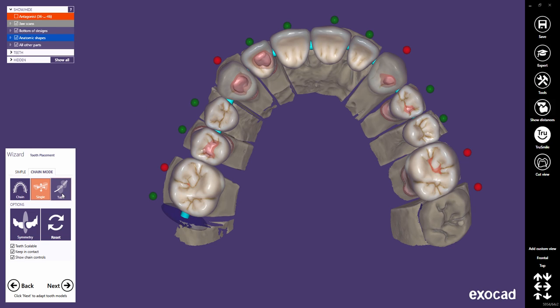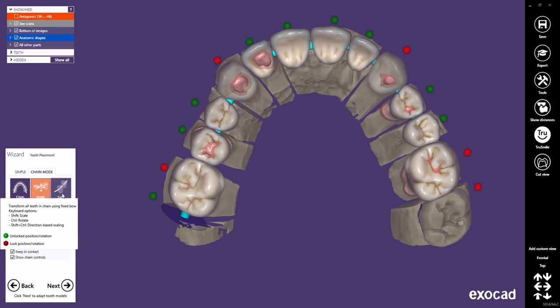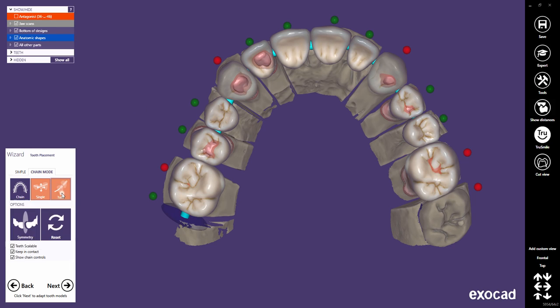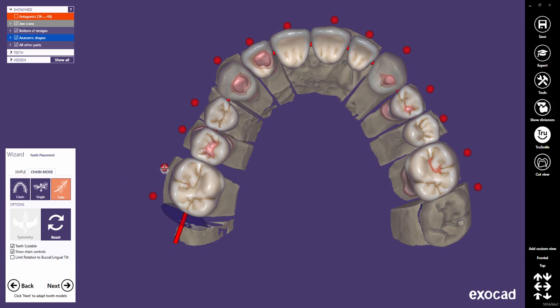Let's now have a look at the tube mode. When working in tube mode, I recommend releasing all tooth positions. Note: with CTRL, SHIFT, and the left mouse button, you can pin or release all teeth.